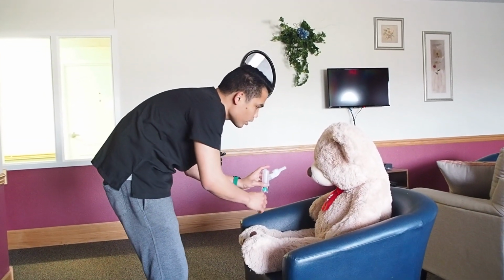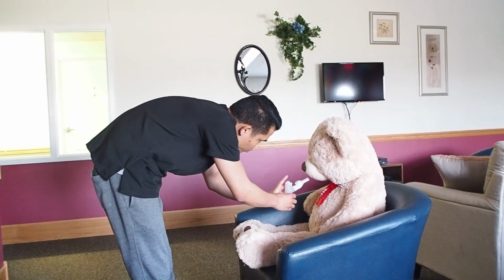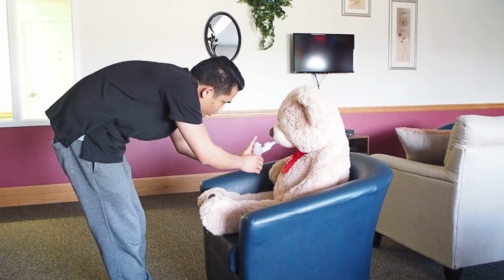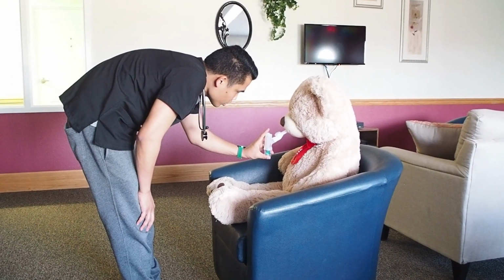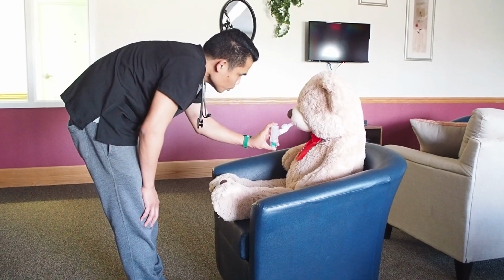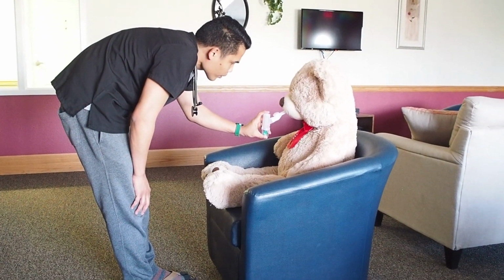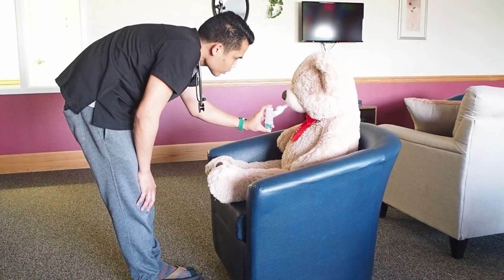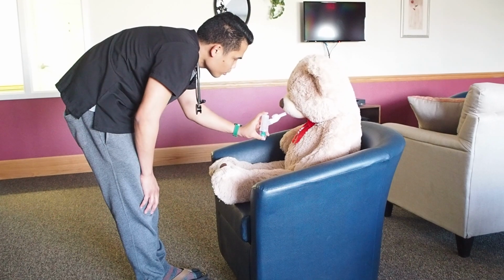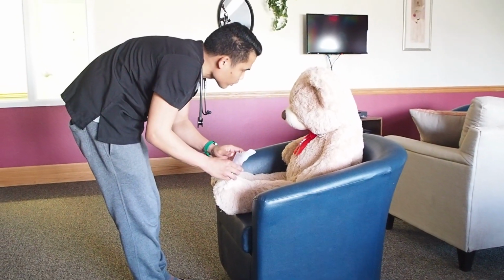So we're ready to go. Put this inside your mouth, lips sealed, and then I'm going to count 1, 2, 3. Okay, 1, 2, 3. Inhale. Hold your breath for at least 10 seconds. Hold your breath, and then remove the device and exhale normally.